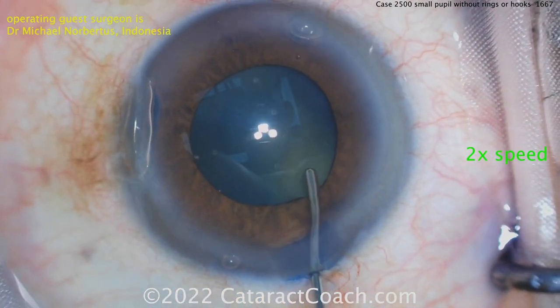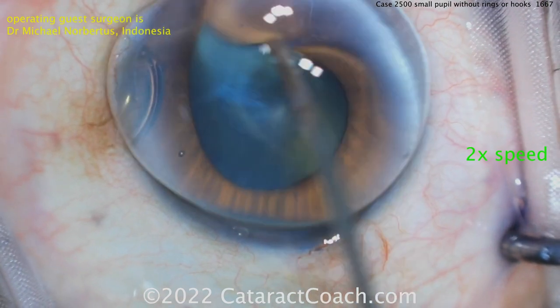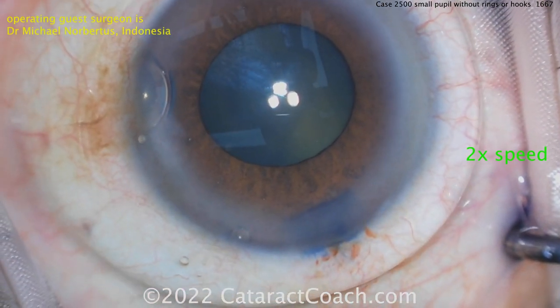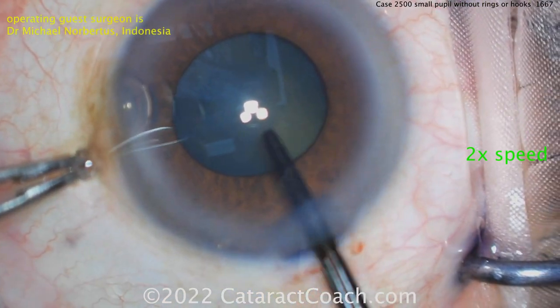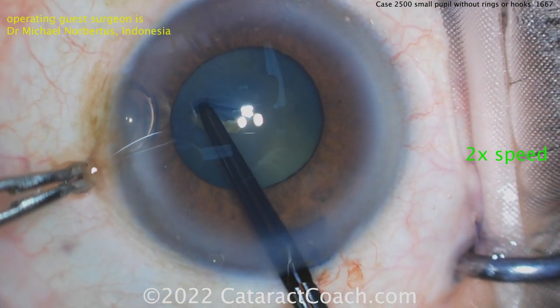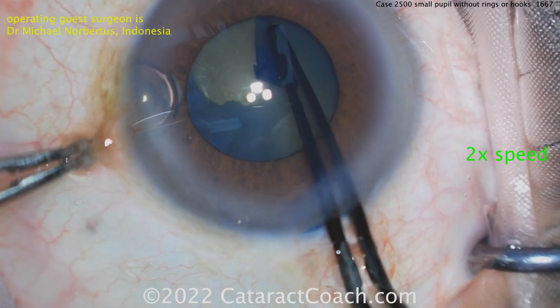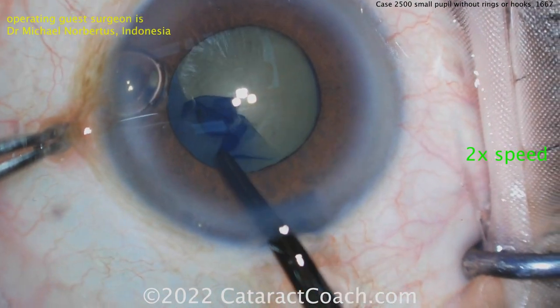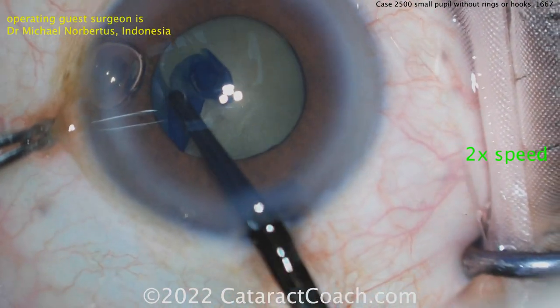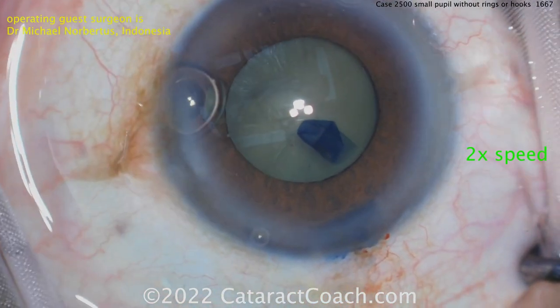Viscomydriasis now expanding that pupil. With the viscoelastic you temporarily have a pupil that's probably five-ish millimeters, four and a half - that's enough. Going in with the forceps, starting off the rhexis here, and now a nice generous rhexis. Look at that - the edge of the rhexis is under the iris or just about at the pupil margin. Fantastic, Dr. Norbertus - you are doing a beautiful job.